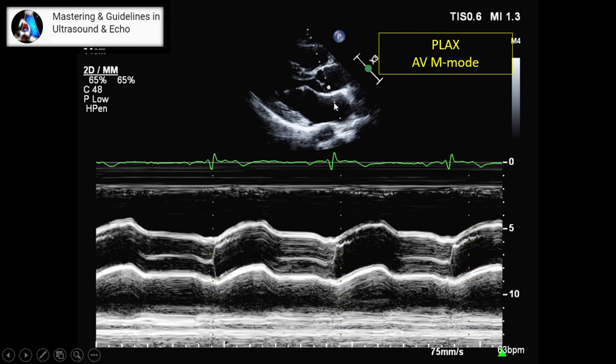You notice here, this is perpendicular to the aorta, but not perpendicular to the left atrium, and the correct way should be perpendicular this way. But if you notice, this amount is almost the same as this one, so we can rely on that measurement. But if there is too much of an angle, we don't measure the third dimension, that is LA.